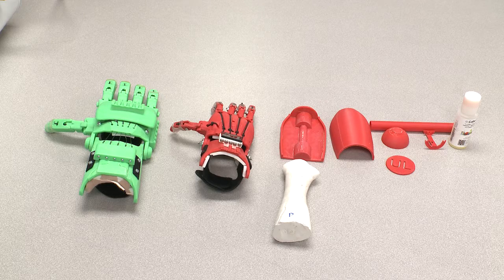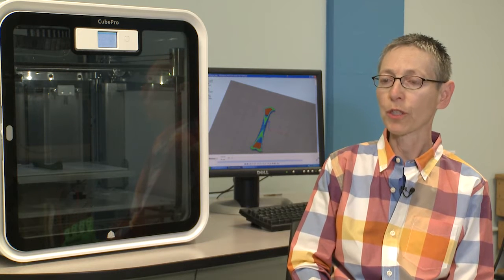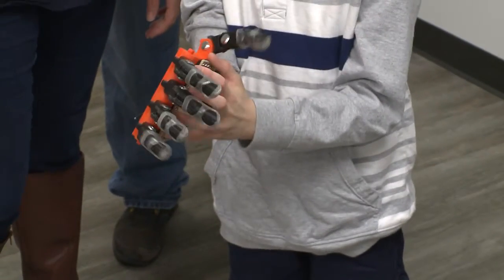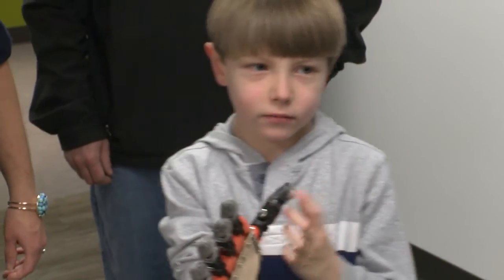They made Robohands to kind of go along with what he's interested in. We used a handheld 3D scanner and created a computer model of his residual limb. Once we had that computer model, we provided it to the entire team to allow them to fit the design so that it would be custom for Lucas. From my perspective as an instructor, I was really looking to give the students the opportunity to understand the disability we were addressing, integrate everything they've learned in their bioengineering and rehab engineering programs, and get to learn some new technology.